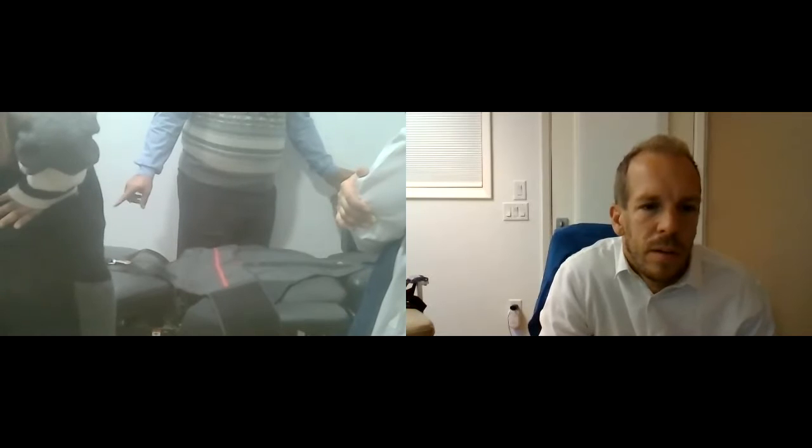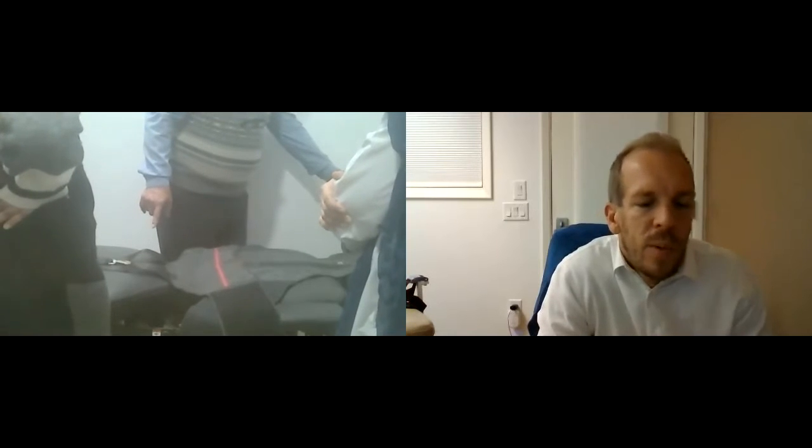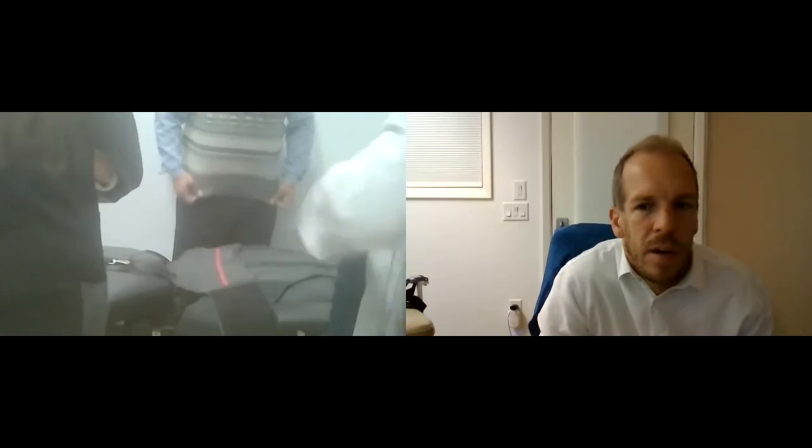The table is always going to be flat when the patient is getting on or off the table. To make it go flat, just hit flat and then begin targeting setup.